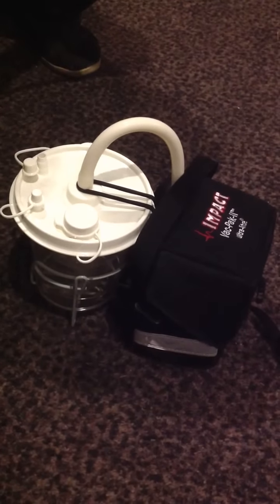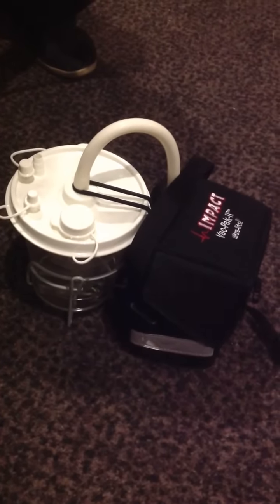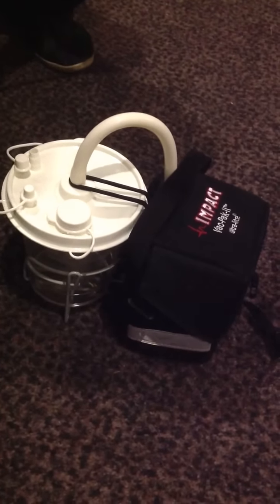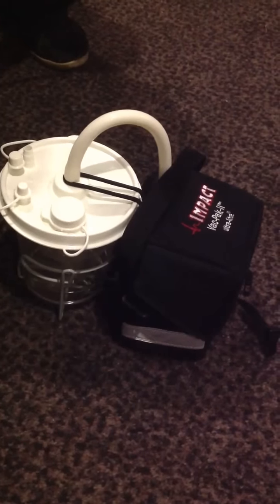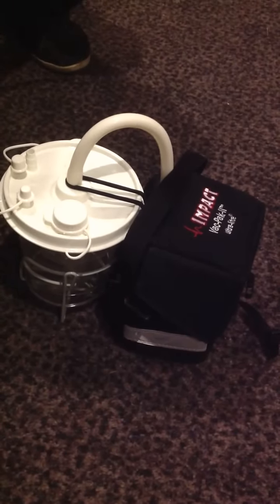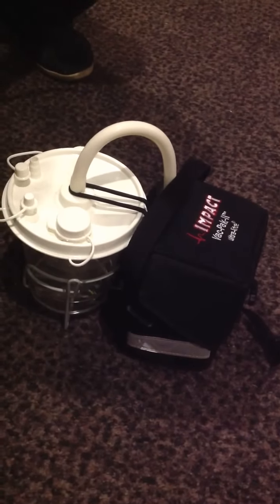When you're doing suctioning, it's important to pay attention to the personal protective equipment that you're wearing. Gloves, glasses, and mask are preferred. In this video, our demonstrator, EMT, does not have these items on, but just visualize that they're there.